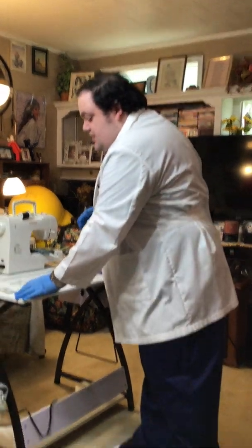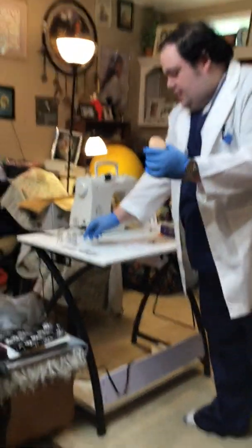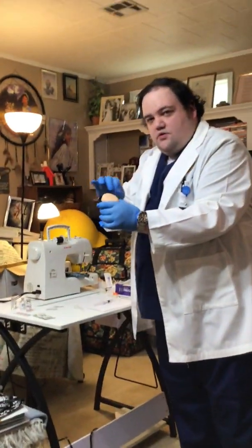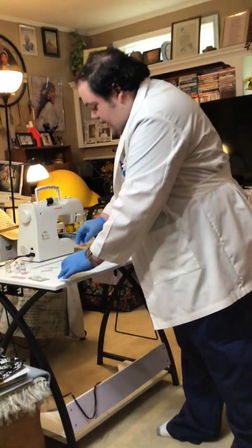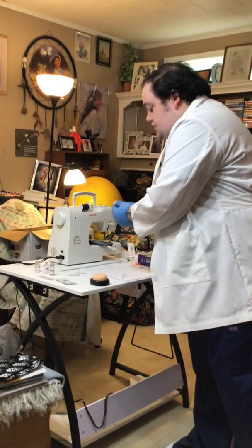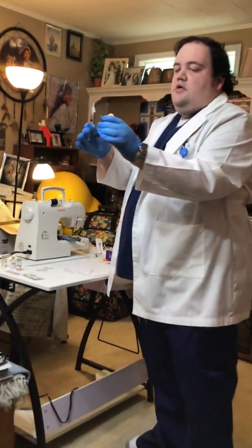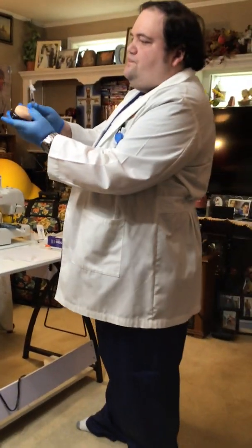So let's say this is his deltoid. I'm going to take my pad and swipe it, my alcohol. And again, IM injections go at a 90-degree angle. That's why we use a longer needle to get into the muscle.